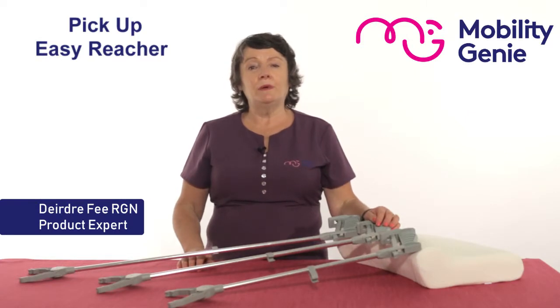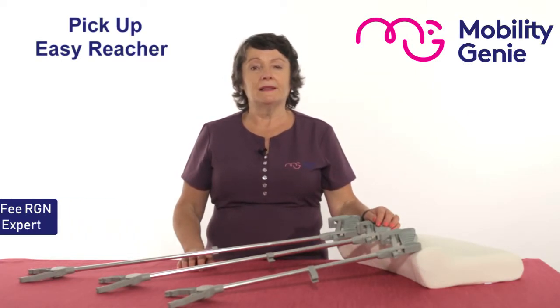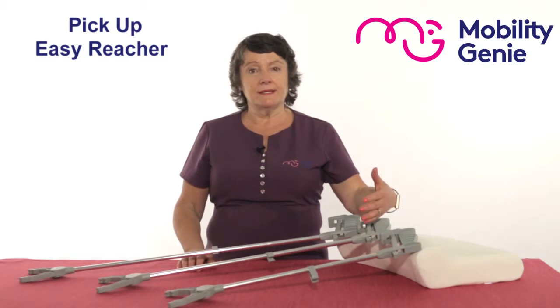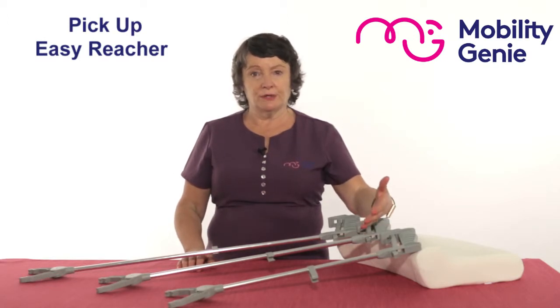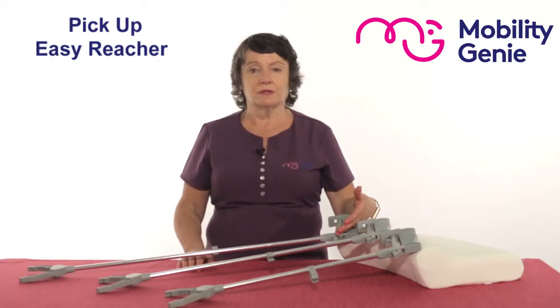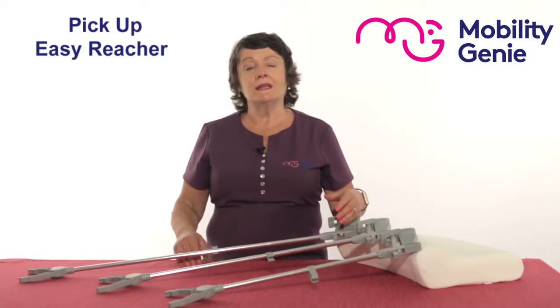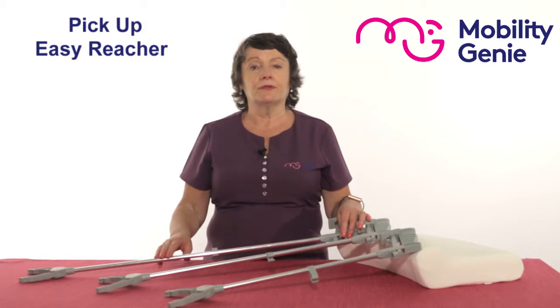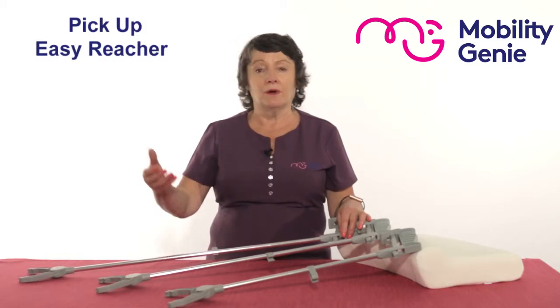At Mobility Genie, we recommend the Performance Health range of pick-up reachers. The other name is an easy reacher. They come in three different sizes: 24 inch, 30 inch, and 35 inch, and what they do is give your arm an extension when you need to pick something off the ground or when you need to pick something from high up.